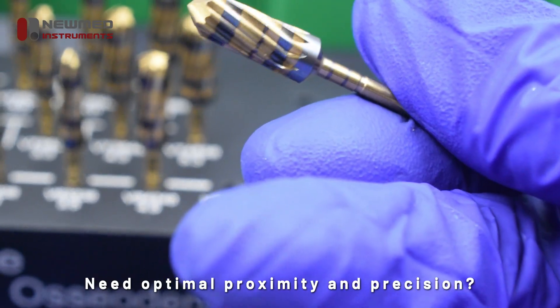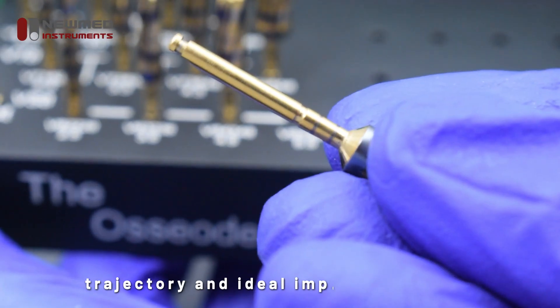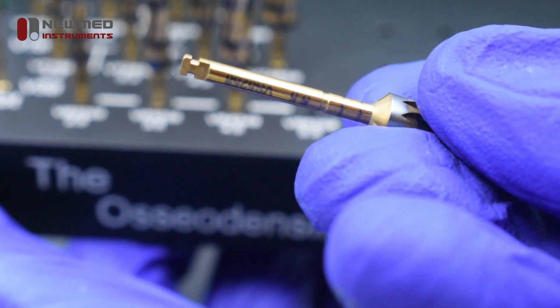Need optimal proximity and precision? The included pilot drill ensures accurate trajectory and ideal implant alignment, helping you achieve better outcomes with less trauma.